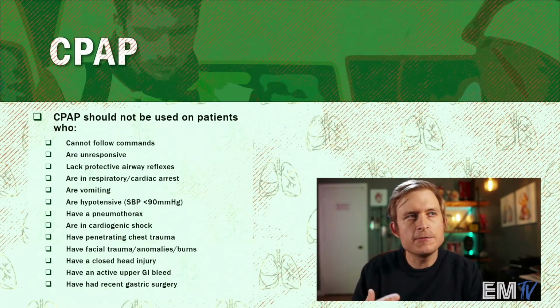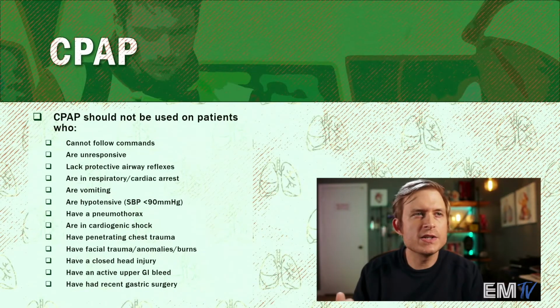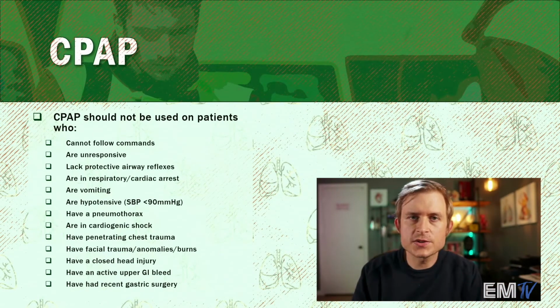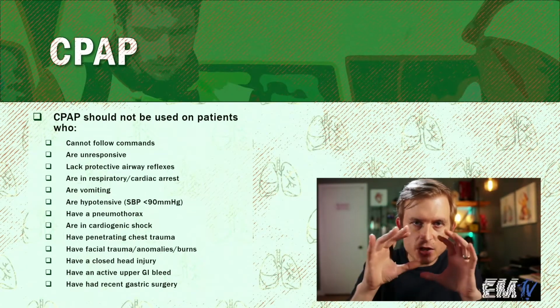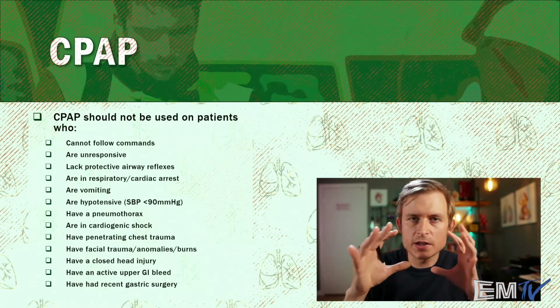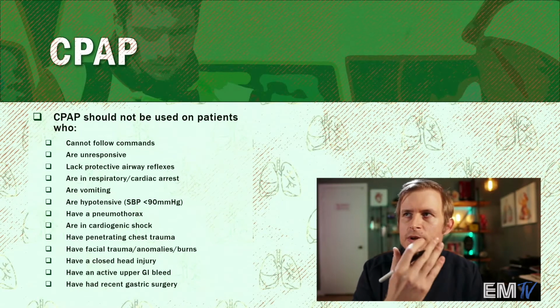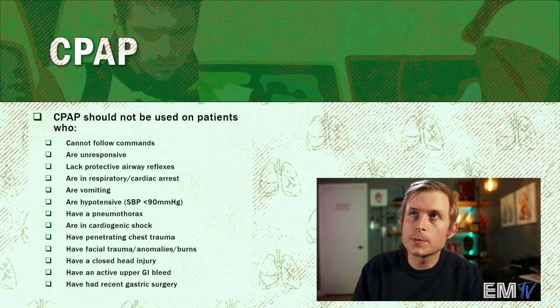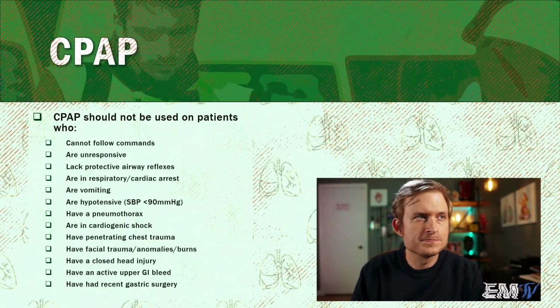Patients who have any facial trauma, any anomalies or burns, anything that would prevent us from being able to attach the mask effectively on the patient's face. CPAP relies on a closed system and needs a good seal around the mask to be effective. So anything that's preventing you from getting a good seal on the face, whether that be a congenital defect at birth or through facial trauma, CPAP won't be as effective.